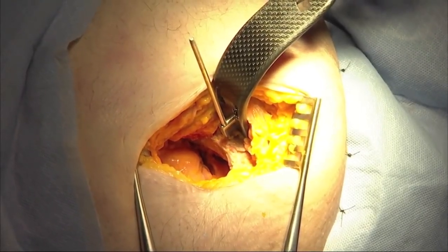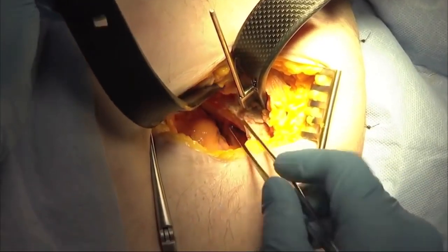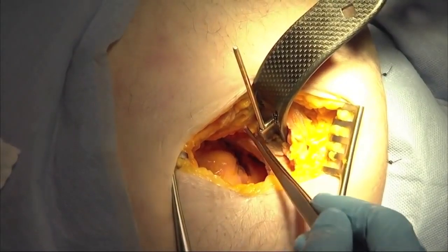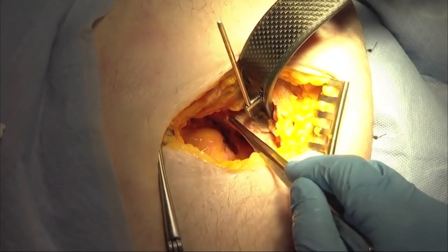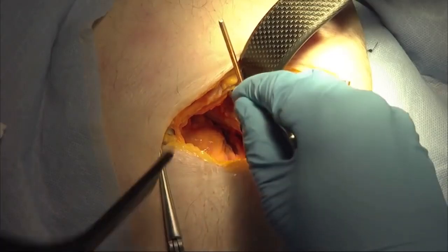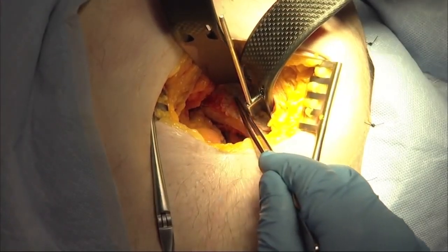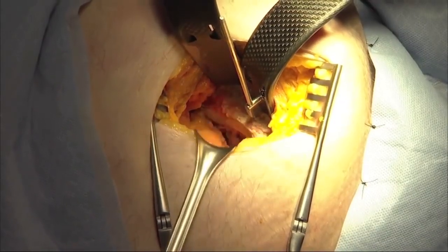The second retractor that Mike showed you is the acetabular wall retractor. The rectus is here above us, and the iliac vessels are right below. It's really important for the visualization and the safety of the patient to keep those vessels well out of the way. So what we're going to do is come underneath the vessels with the retractor and gently hook that retractor on the anterior lip of the acetabulum, which is right here, and then bring those vessels and the rectus further out laterally.